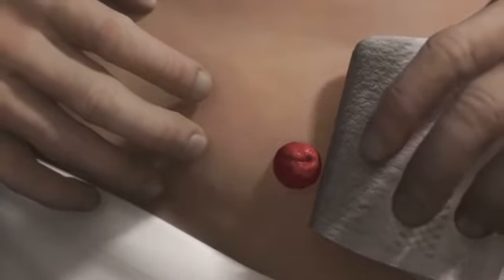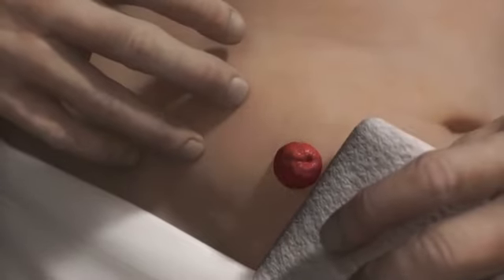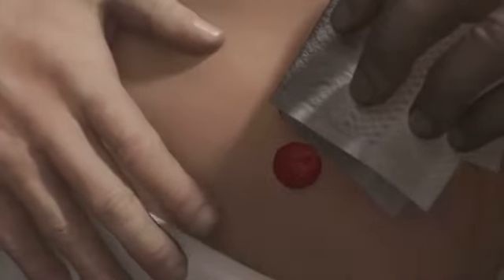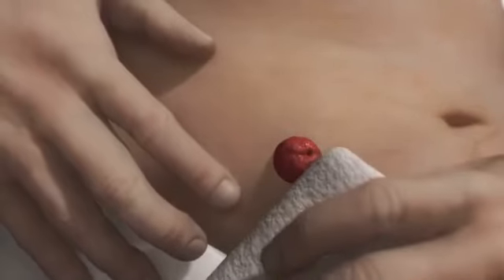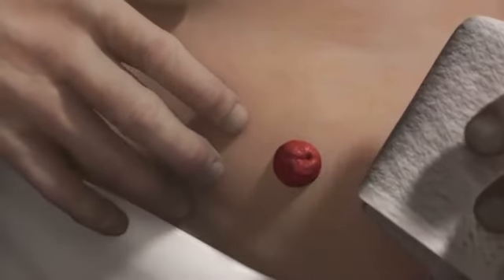Dry the skin gently and carefully. Any moisture on the skin around the stoma should be dabbed off and the stoma allowed to air dry. The skin must be completely dry before applying the next adhesive. If there is any moisture, the adhesive will not make full contact with the skin, which results in risk of leakage and skin irritation.